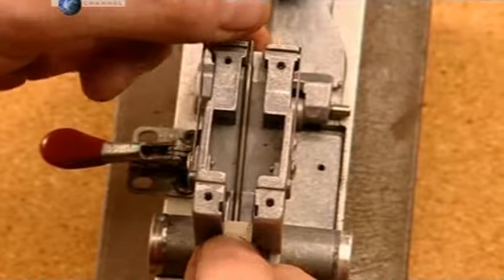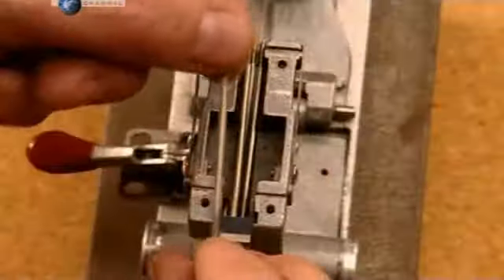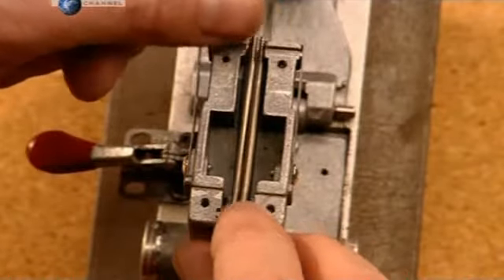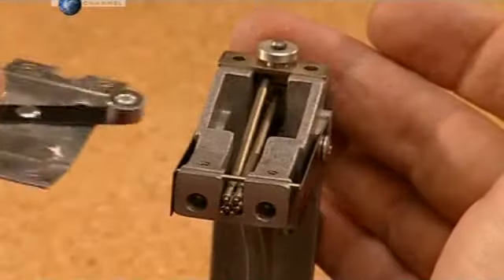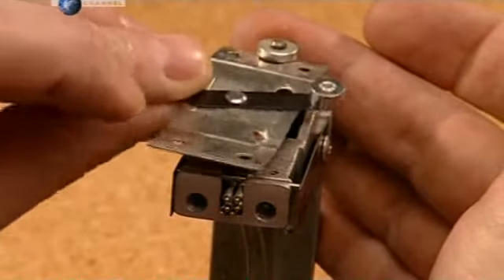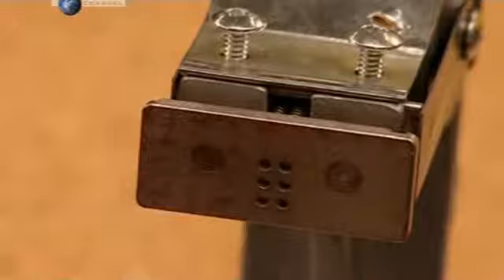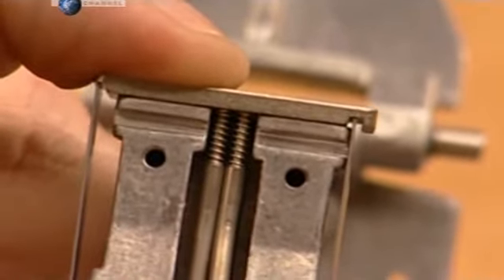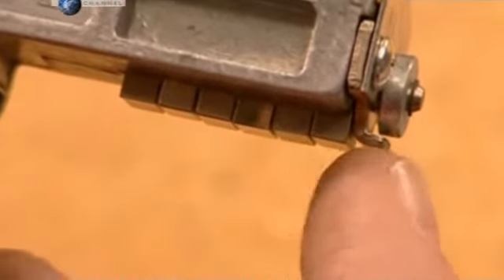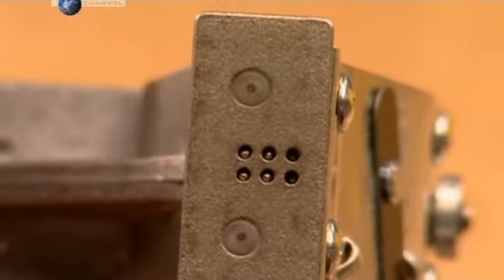To build a Braille writer, the 6 styli are positioned one by one in a carriage, with steel spacers in between. The spacers ensure each stylus can move freely. A cover plate seals the back of the carriage, and what's called a stripper plate closes the top. The plate has 6 holes in the configuration of the Braille cell. When a key is pressed, the corresponding stylus protrudes and strikes the paper against a dot-shaped die, creating a raised dot.